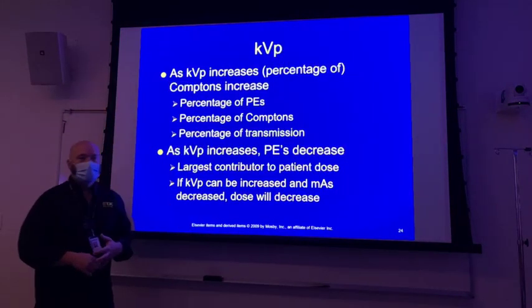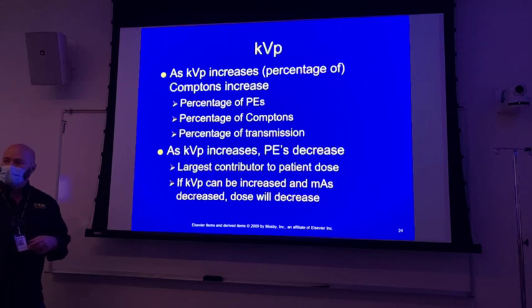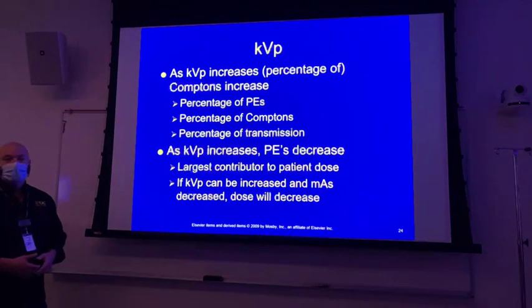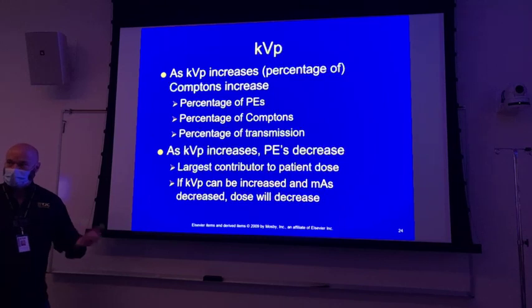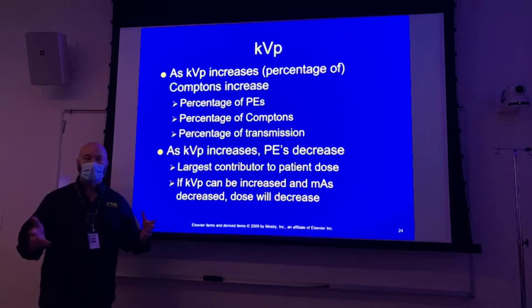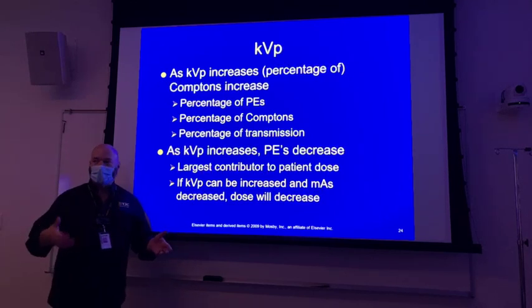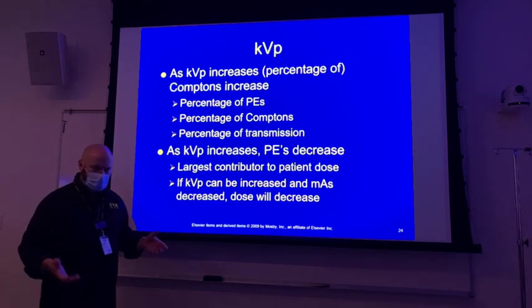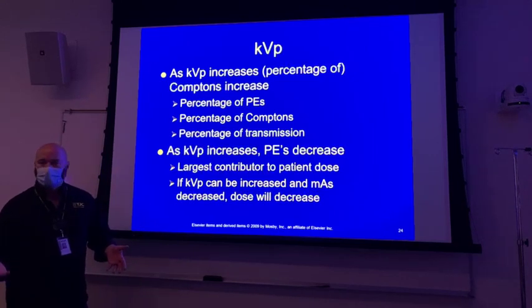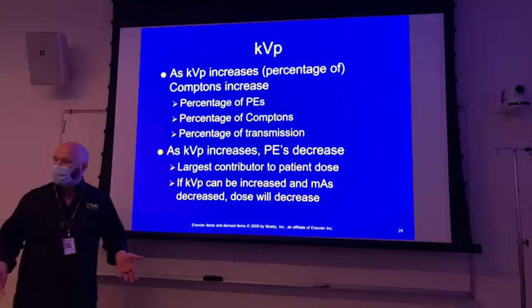So, next time you're at clinicals, turn your portable off and try to push it. Okay, you're going to find two things. One is it's motor driven, and if the motor is not working, if it's not energized, it's hard to push. Okay, but most of your machines will have a way to disengage the motor. Like the old GE portables, there was a little button right up under the handle you could push just in case your portable died, but you had to push it somewhere.